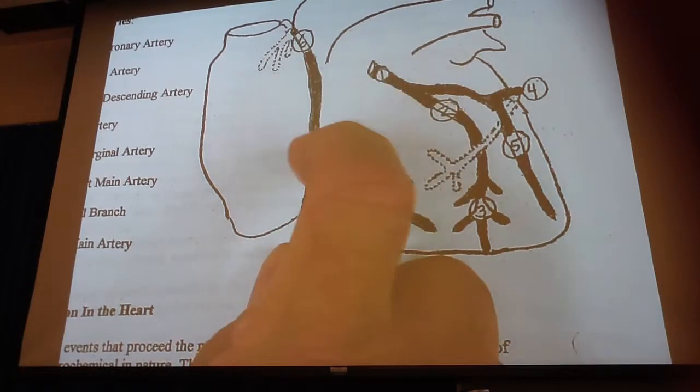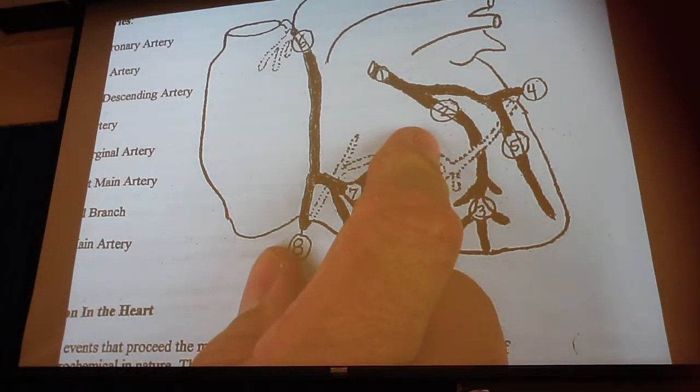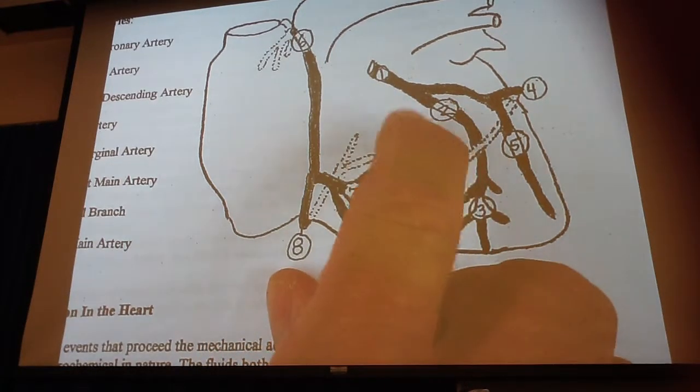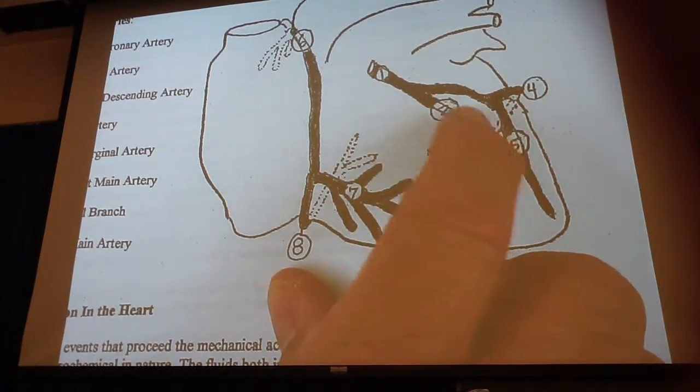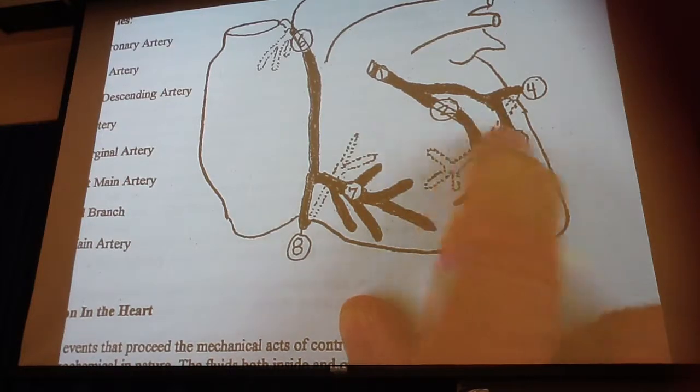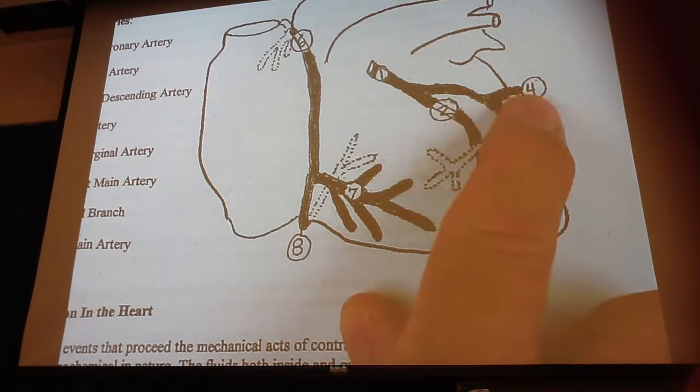I mean, actually, either one of these is fairly serious, but on this one here, so you have the left main, and then on number 2 here, they may call this a left diagonal artery, and then from that you have the left anterior descending coming down. Okay. And then on number 5 over here, the marginal artery, and then the circumflex.